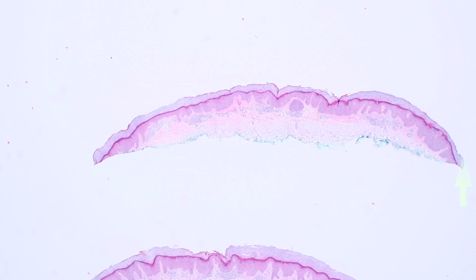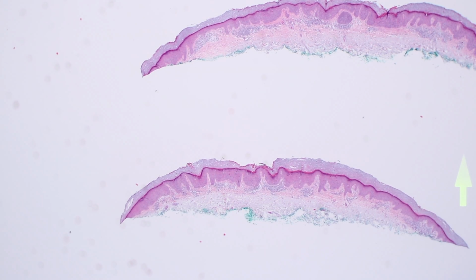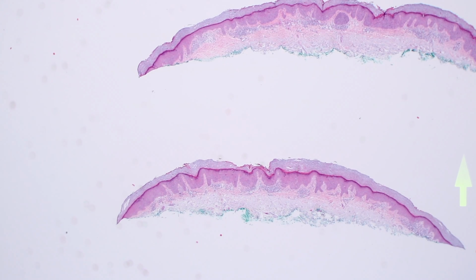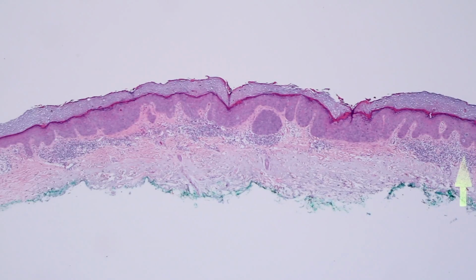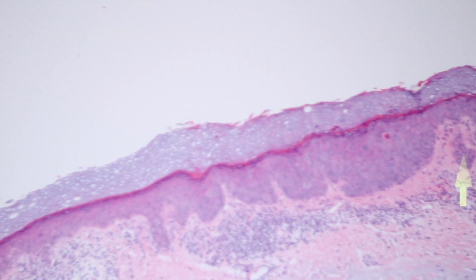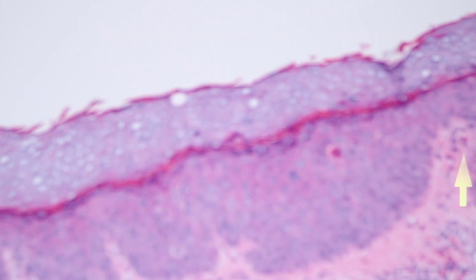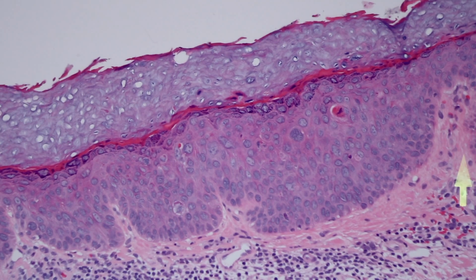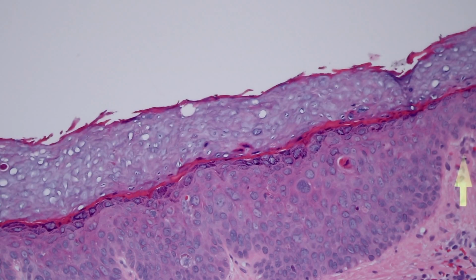All right, so there's pigmented squam in situ. Here's a case where, again, from low power, this doesn't stand out. The corneal layer looks thick, but it looks like nice ortho. This is dorsal hand, probably. And so you might think this is just like lichen simplex chronicus from scratching, or maybe a thin seb or something. But a closer look, it's that same thing. It's those hyperchromatic, atypical, jumbled guys. They're kind of monotonous and uniform, but they're too hyperchromatic and too packed closely together for normal epidermis. Like this would be normal here, and then this is squam in situ.